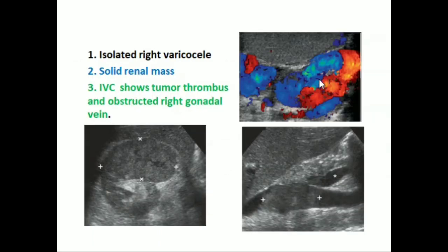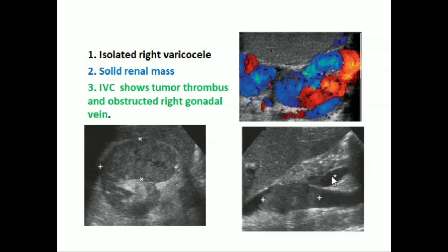This is an isolated right-sided varicocele. On abdominal survey, there was a mass in the upper aspect of the right kidney, and the IVC shows a tumor thrombus definitively blocking the right gonadal vein.